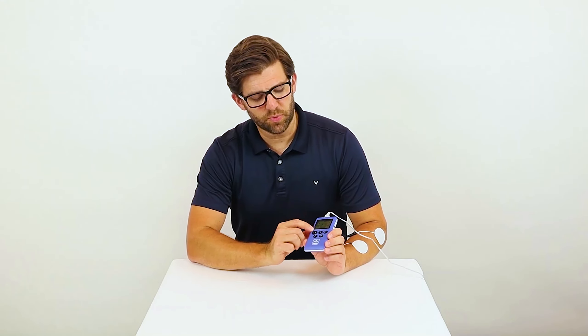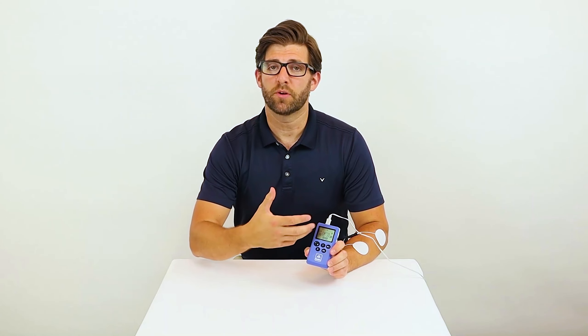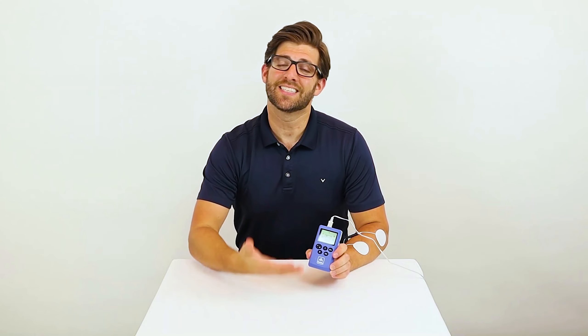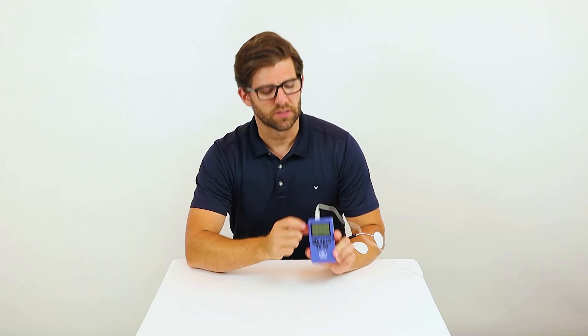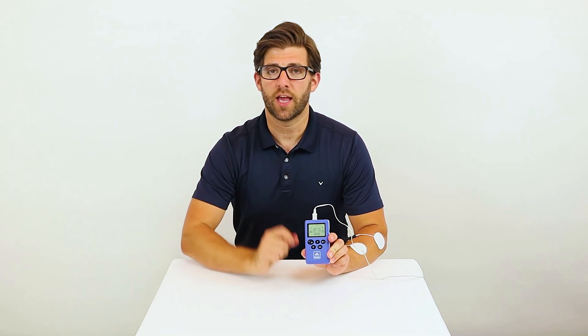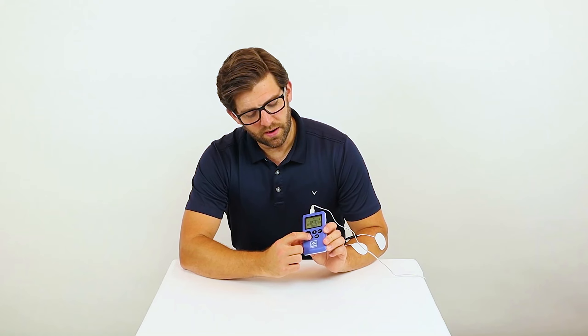If you notice, the display is quite large compared to other ones on the market. This allows you to adjust parameters and see what you're doing and see the stimulation a lot easier. Next push the channel button so that the A is flashing since I have the lead wire in channel A.